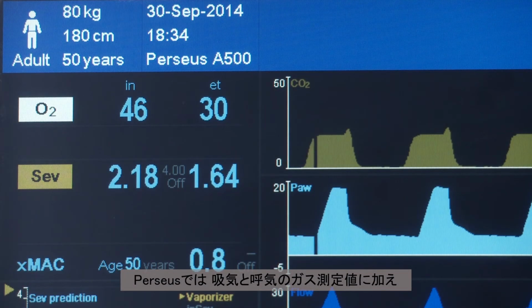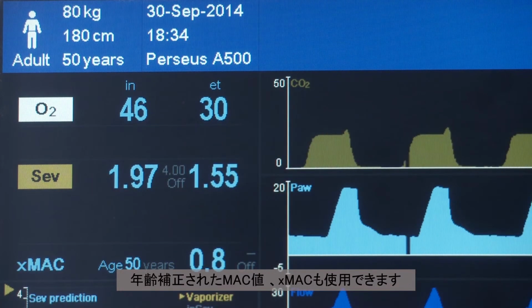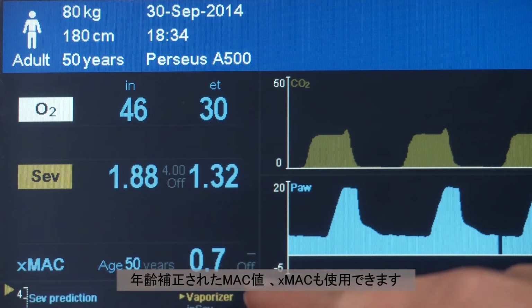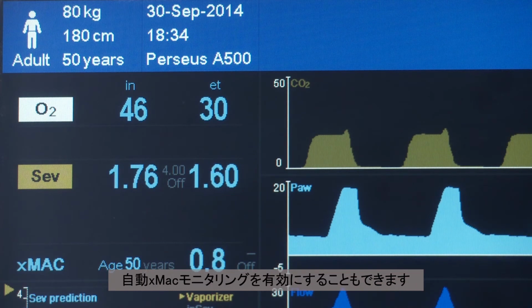In addition to gas measurement values, i.e. the inspiratory and expiratory readings, Perseus allows you to use age-corrected MAC values, the so-called XMAC. This can be monitored via an automatic alarm function.